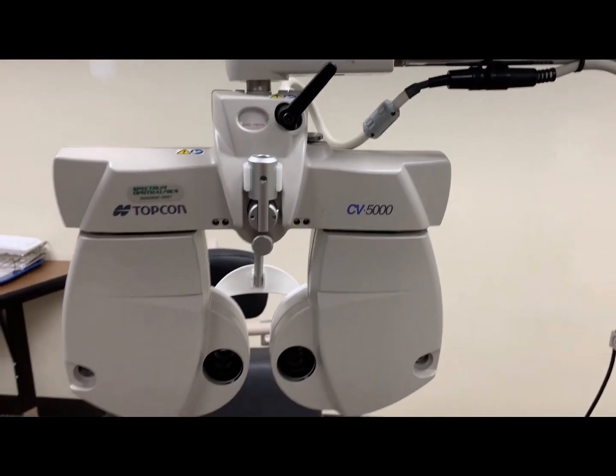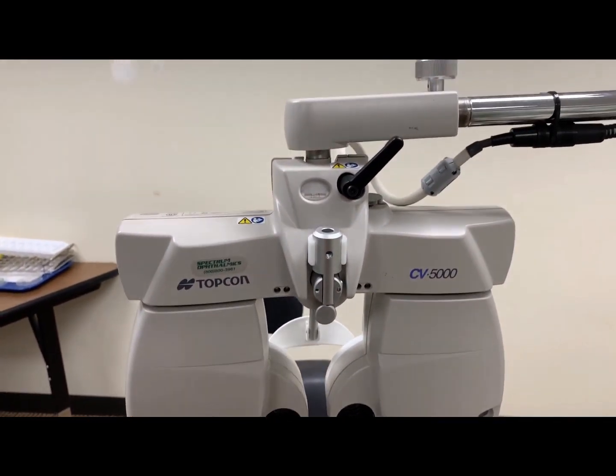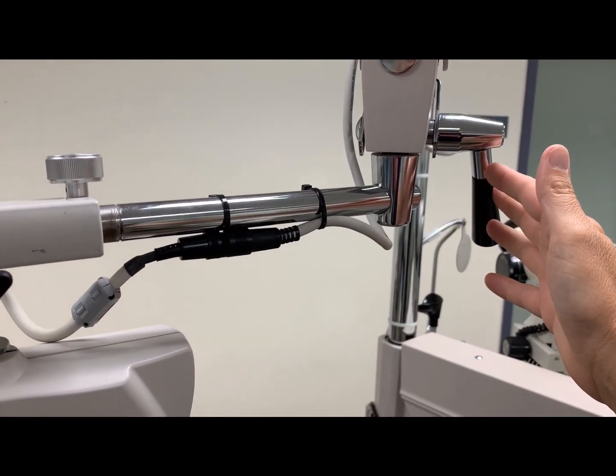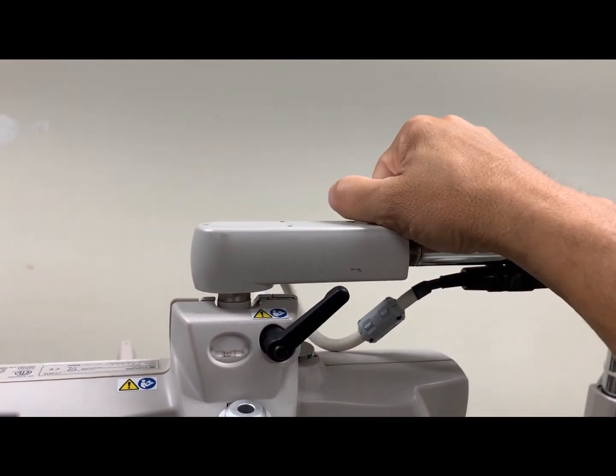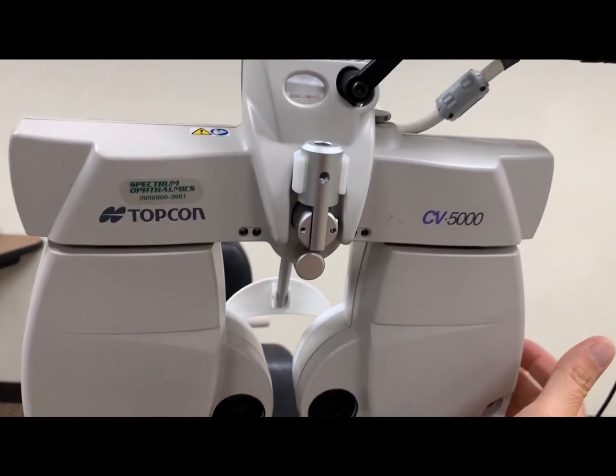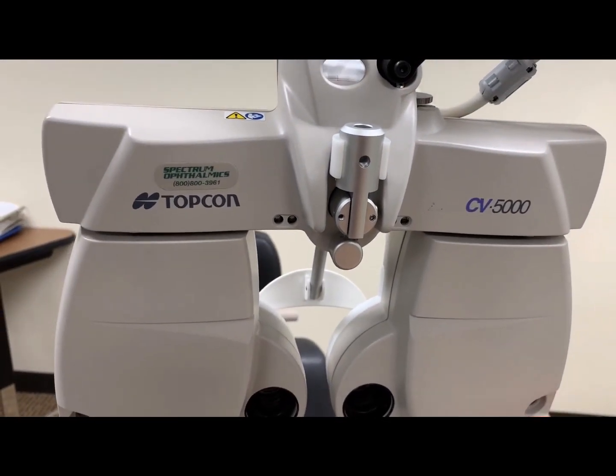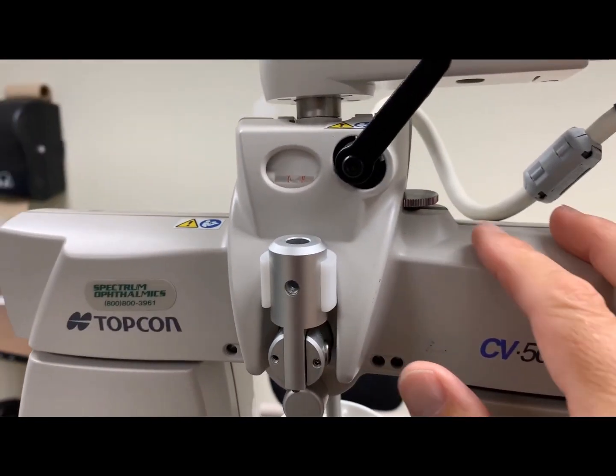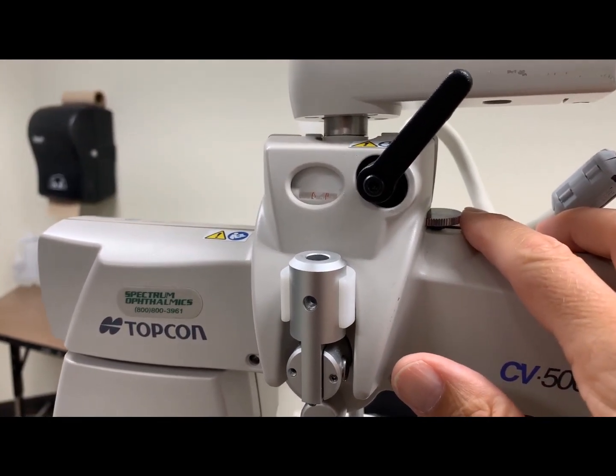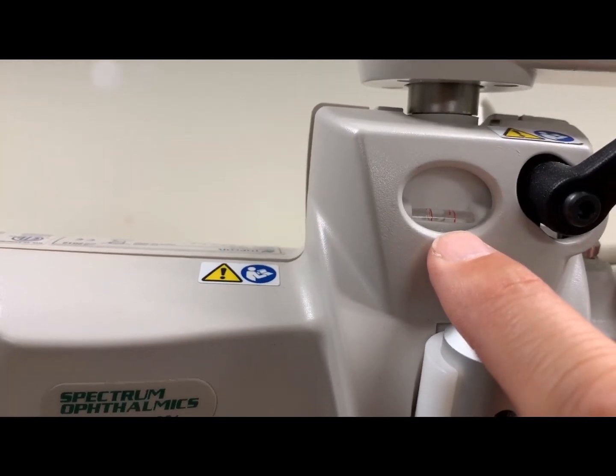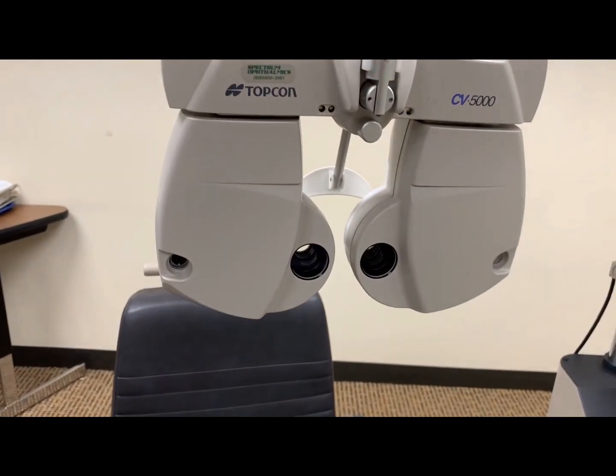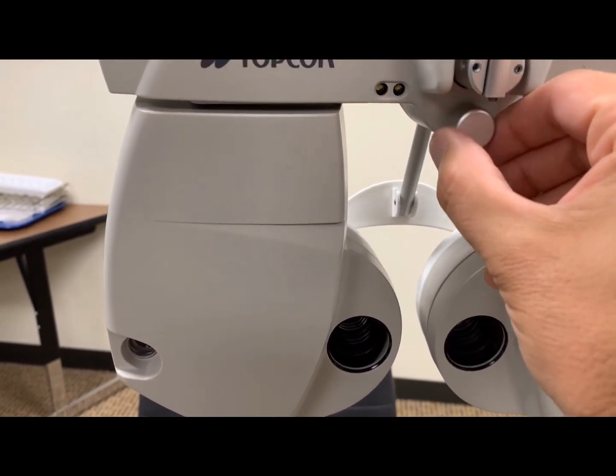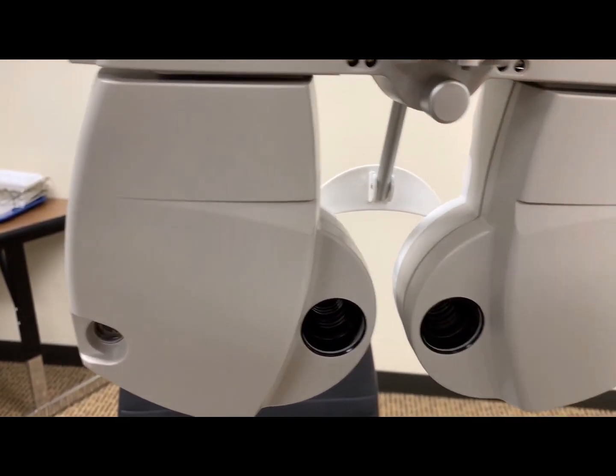This is a brief intro to the Topcon automated phoropter system. Same basic locks as before. The arm lock to swivel the instrument in front of the patient. The lock on top of here, which will allow you to either tip the bottom of the instrument closer to the patient or bring it further away from the patient. Ensure that that's locked into place. The balancing of this particular instrument occurs with the knob on the side. And you'll notice that there's a level within the instrument. Changing the forehead rest is located with this knob here. And you'll see that you're able to move the instrument further and closer to the patient.